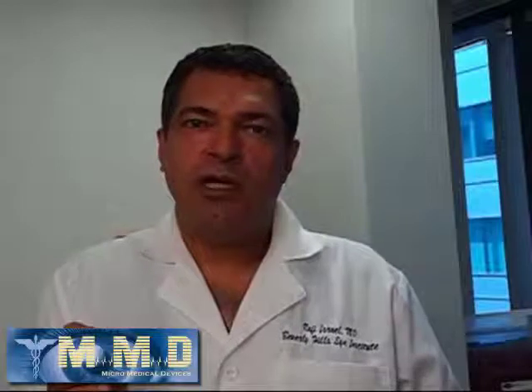So what I would like to re-emphasize is that with this technique, you don't want to press on the eye, you just want the meniscus to touch the cornea, and at that point you want to instruct the patient to look directly at the blinking light and then hold the probe in position until the capture starts.